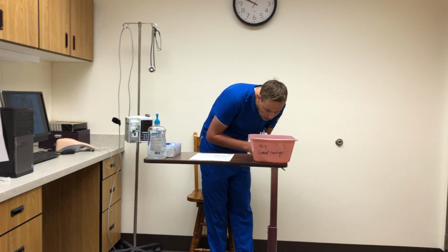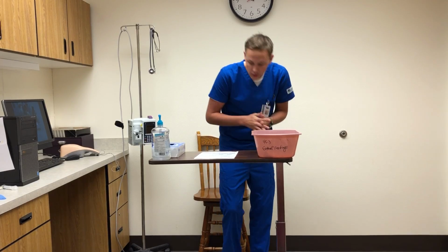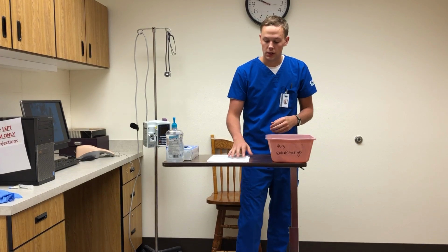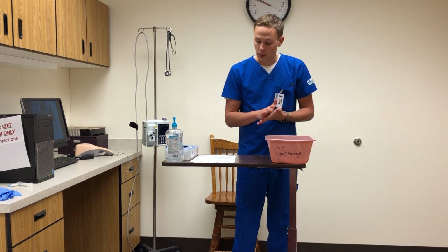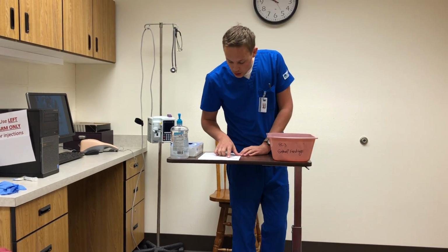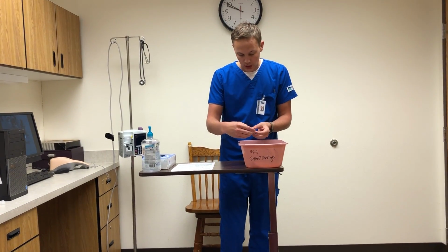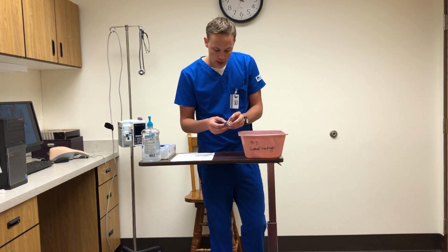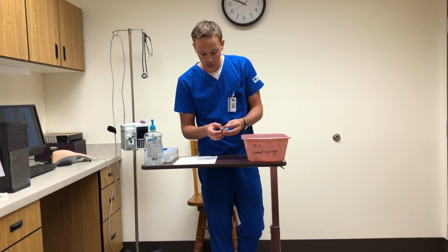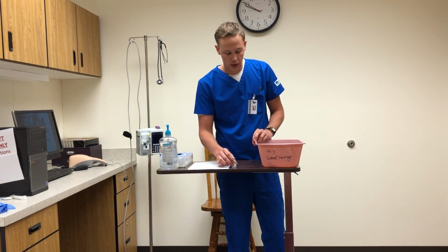And right here we have Shirley Coast, 54-year-old female with the date of birth of 5/14/1964, and that matches my MAR for Shirley Coast, 54-year-old female, 5/14/1964. So I can begin with doing my first check since I know that this is the bin. And so the first medication is that NPH insulin. Here it is, NPH insulin, and then there is a tag with her name and information on it and her barcode. So Shirley Coast, 54-year-old female, 5/14/1964. So I know that that's hers.